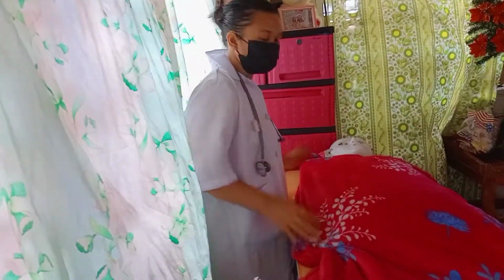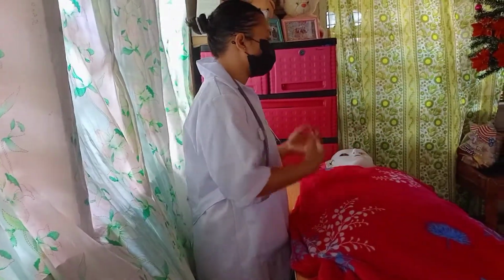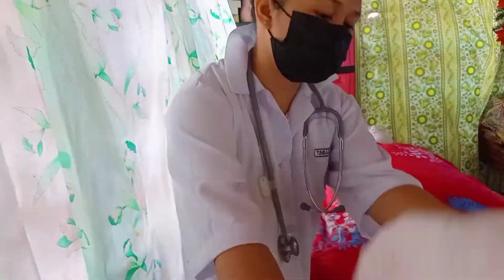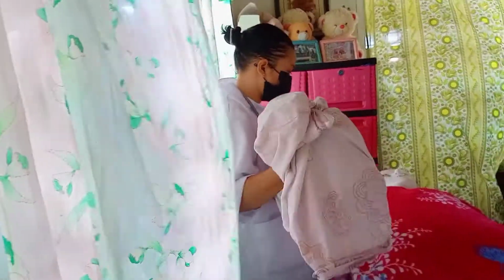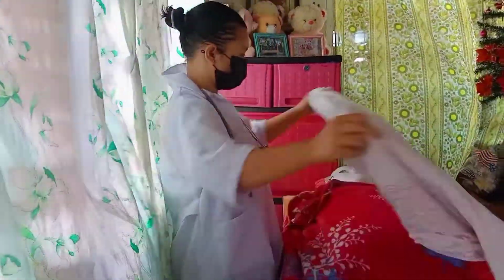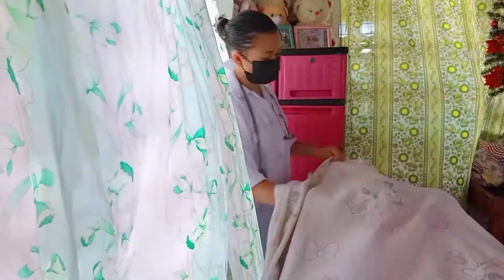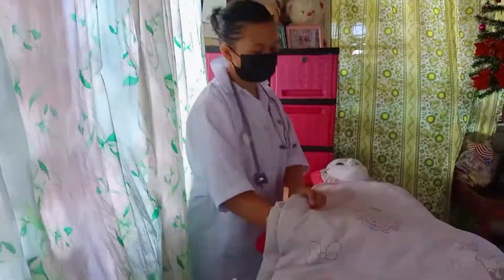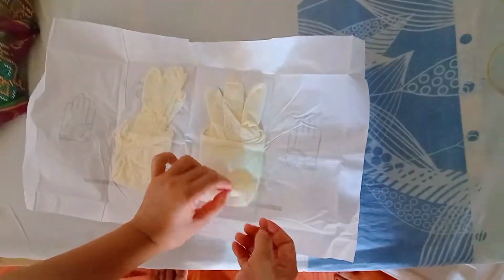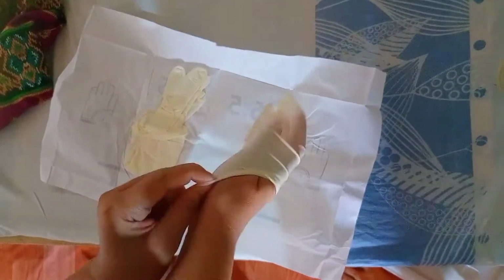Next is drape the patient with a bath blanket to allow for the patient's privacy. So, next, ma'am, magbutang na ko og bath blanket po, ma'am. Next is don gloves, which prevents the transmission of intestinal bacteria.